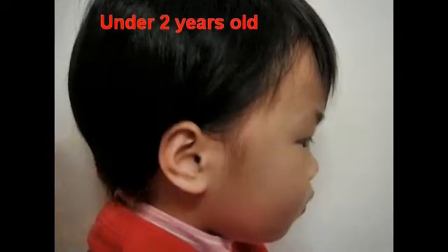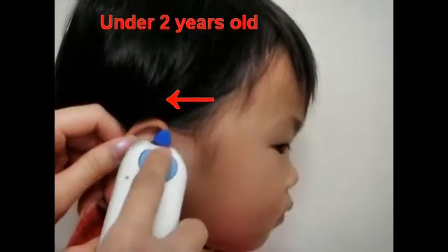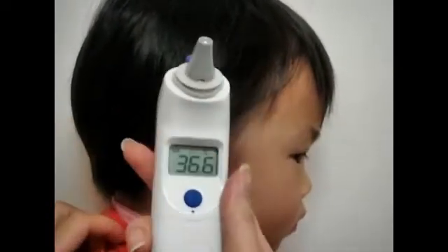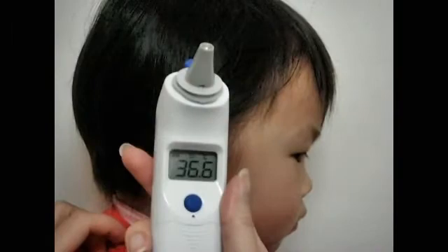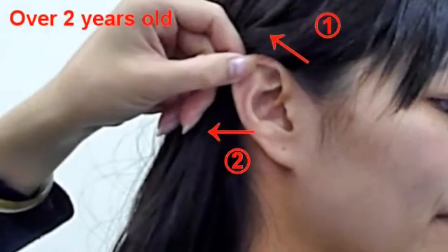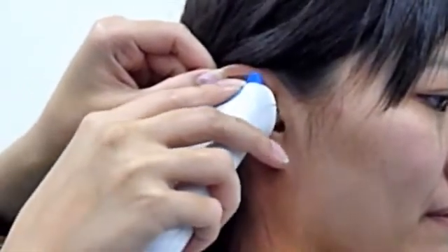For children under 2 years old, gently pull the ear straight back to straighten the ear canal, then put the probe in the ear canal and press the scan button to get the temperature. For children over 2 years old, pull the ear up and backward to straighten the ear canal, then press the scan button to get the temperature.